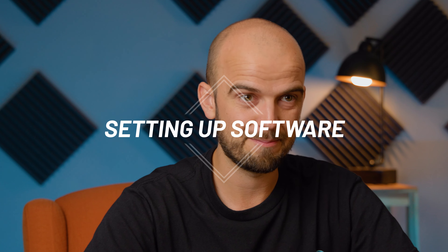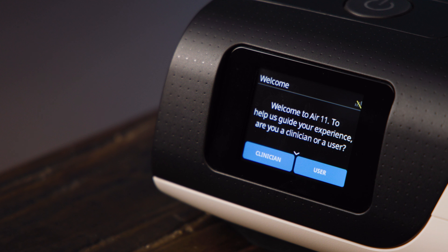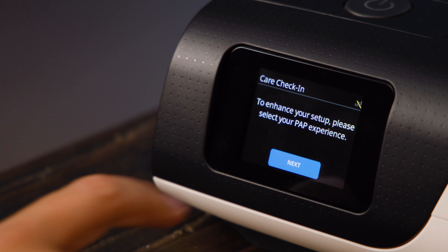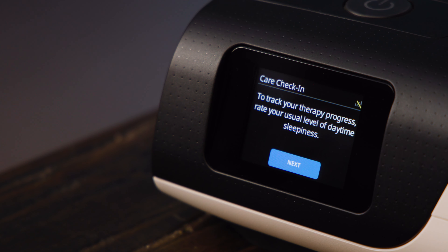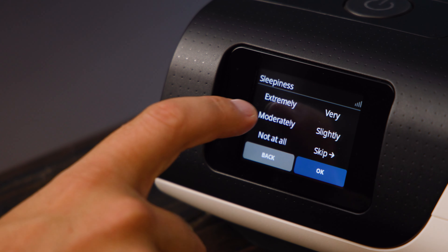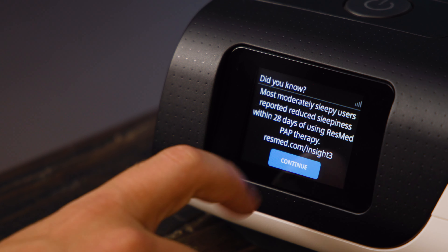With the physical pieces in place, you now need to get the software set up. As soon as the unit receives power, the screen will come to life. Depending on your unit, you might be asked to select your language first, or you might be taken straight to the welcome screen. Either way, you should select User from this screen. You'll then be prompted to personalize your unit, responding to a few background questions about your therapy and apnea. Further questions will be asked at certain points over the first month of your usage, and your responses are recorded by the device to provide tips and support.